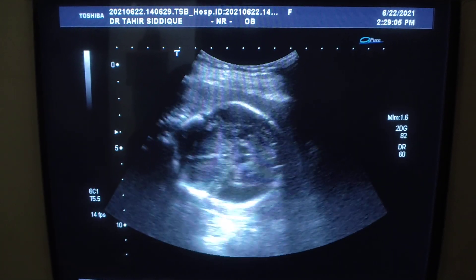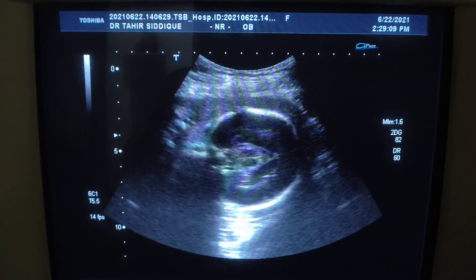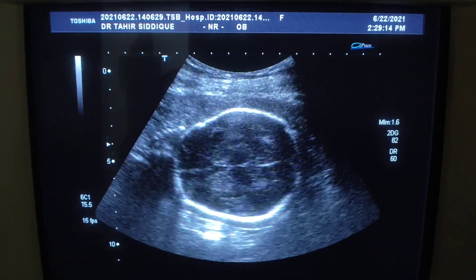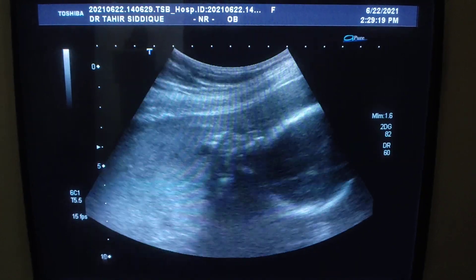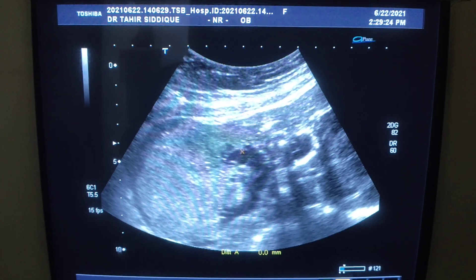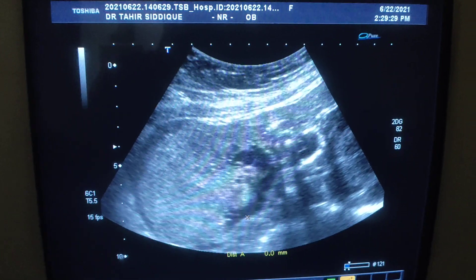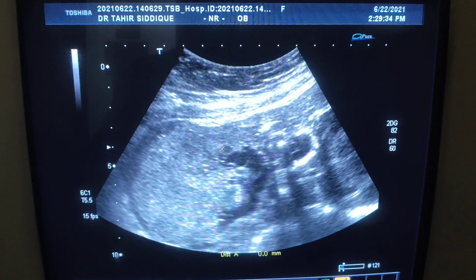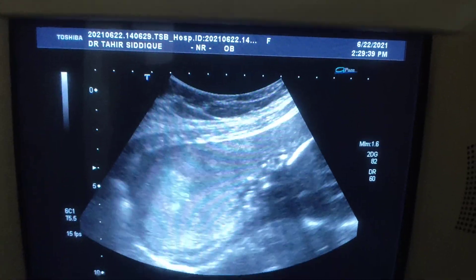This is a 24-week gestational age fetus — this is the head of the fetus. It is a case of anhydramnios almost. This is the only fluid that can be seen in the entire gestational cavity; this is the only fluid pocket in this gestation. This is the placenta, which is fundal, and the patient is hypertensive.